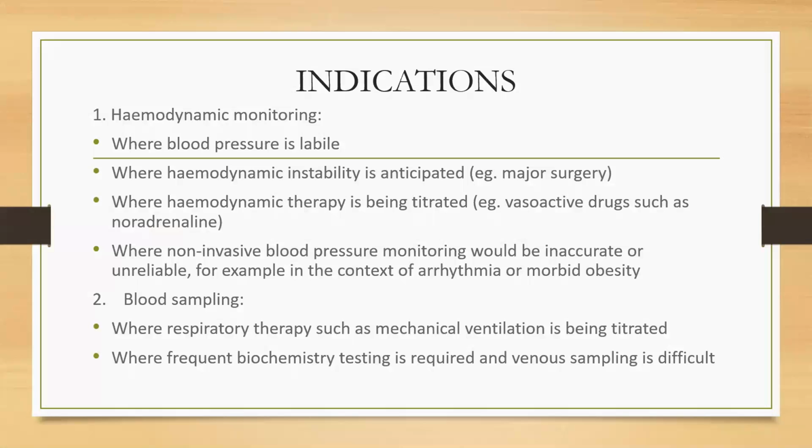Indications. Hemodynamic indications include blood pressure when it is very labile, where hemodynamic instability is anticipated, where hemodynamic therapy is being titrated, for example, patients in whom vasoactive drugs like noradrenaline infusion has been started, and where non-invasive blood pressure monitoring would be inaccurate or unreliable, for example, in the context of arrhythmia or morbid obesity.